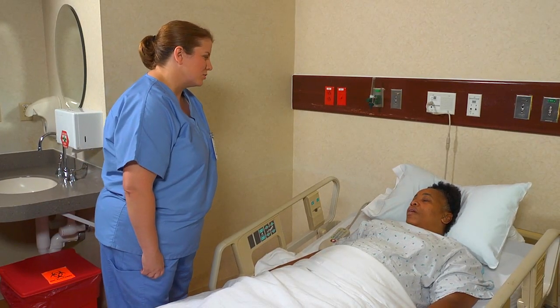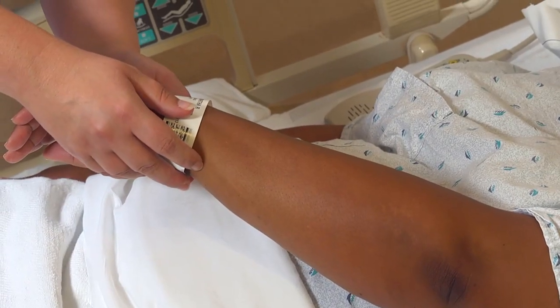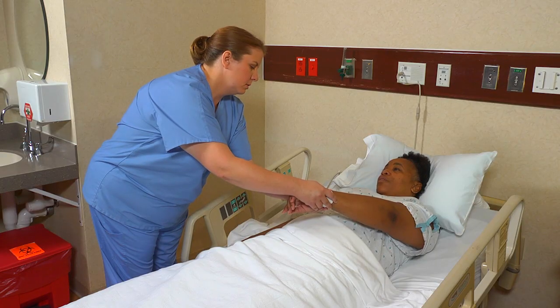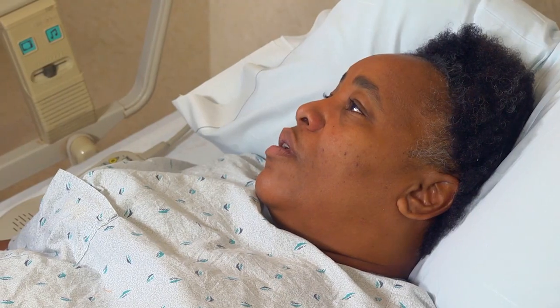Hi, my name's Marci. I'm going to be your nurse's assistant today. I'm going to check your identification. Can you tell me your full name and date of birth? It's Monica Turner, 10-25-61. Ms. Turner, I'm going to get my supplies. I'm going to change your abdominal dressing this morning.